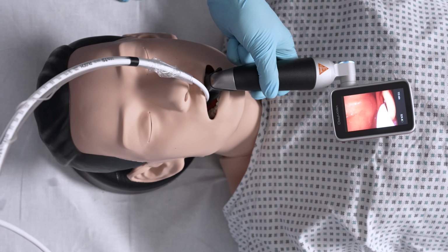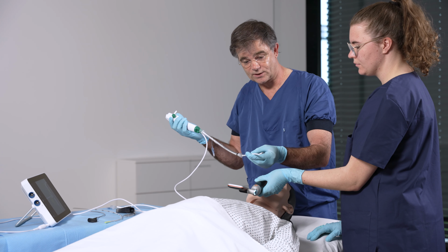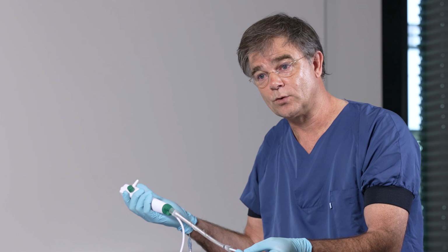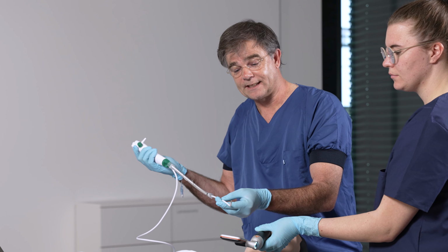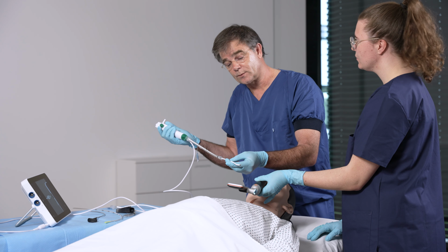So this is VAFI, and this is a perfect rescue technique, a dual camera technique for patients in the ICU who were accidentally detubated. This is a very good technique for patients who come into the ER with bleeding airways. If you use two cameras, one of the cameras will probably have a view. And this is also a very good technique to learn how to use a flexible scope.